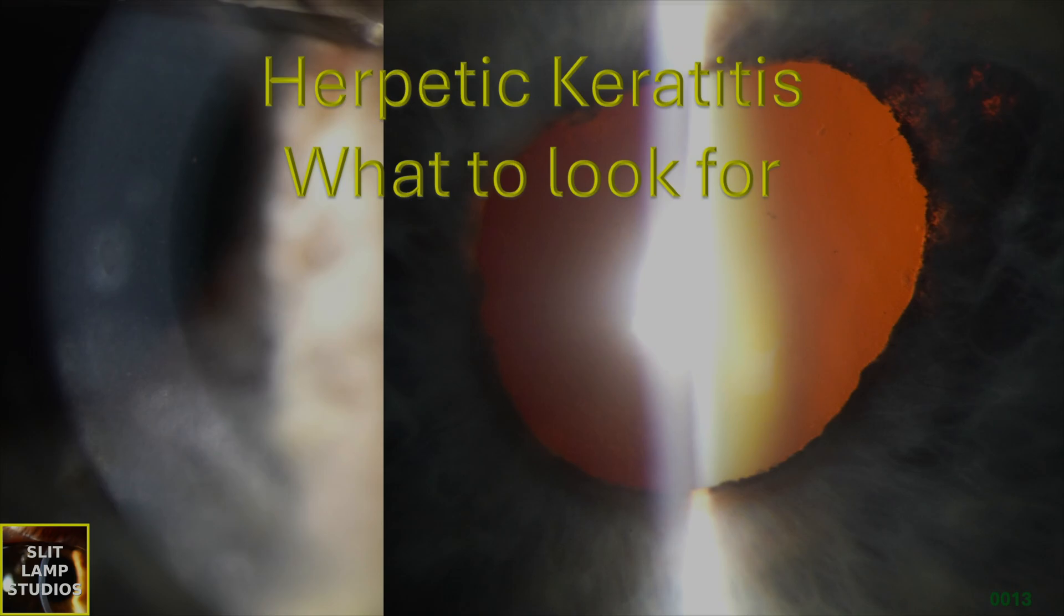Herpetic keratitis, what to look for. I'm going to give you some pearls and tips on slit lamp examination of patients with herpetic keratitis.